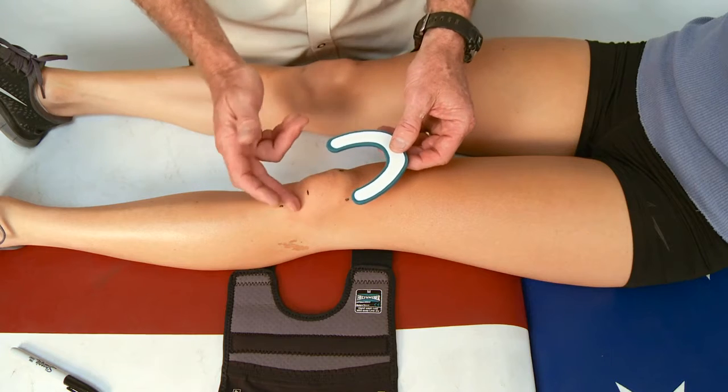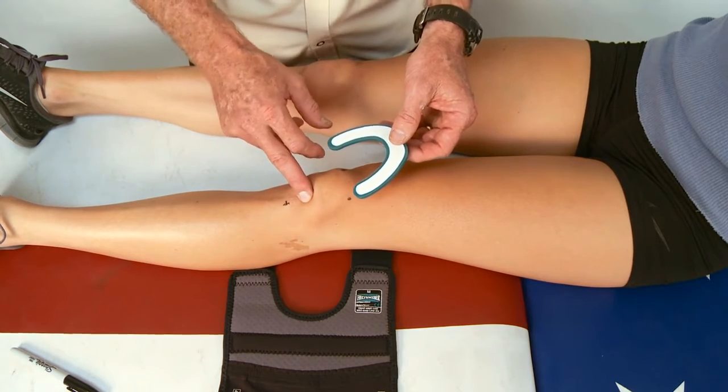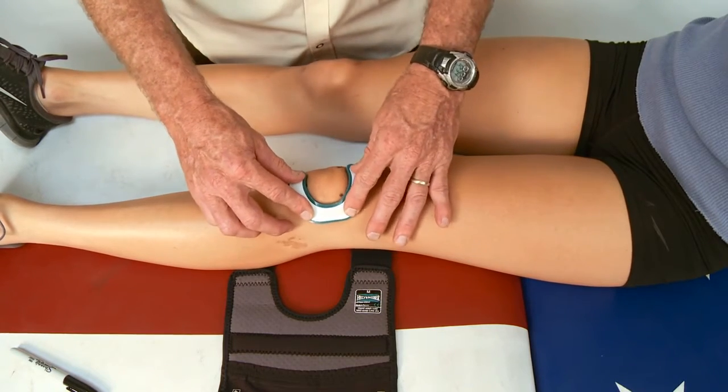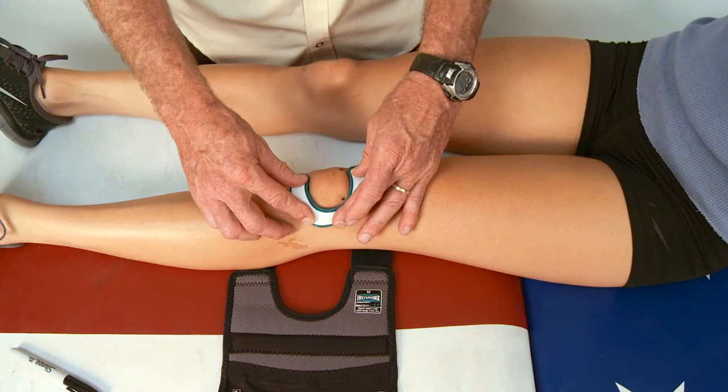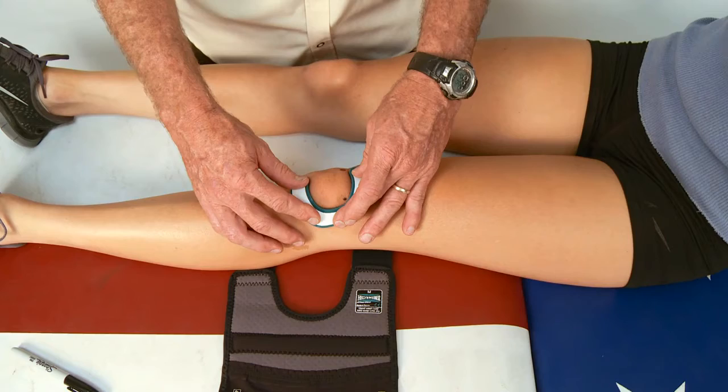Sometimes in the patella alta, it's because someone's wearing a tendonitis strap that will tend to stretch out that ligament. Therefore, applying the Shields brace, once the buttress is in place, and doing eccentric exercises will allow that joint to tighten up and to decrease pain and to allow increased function.